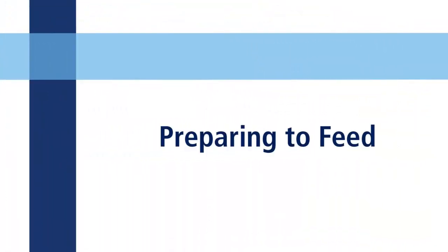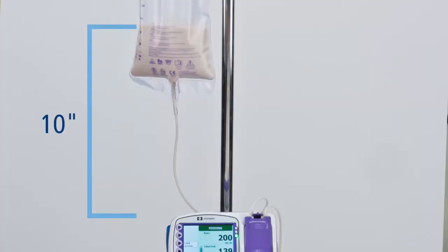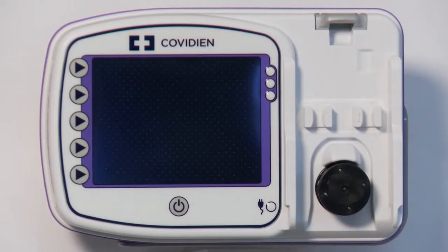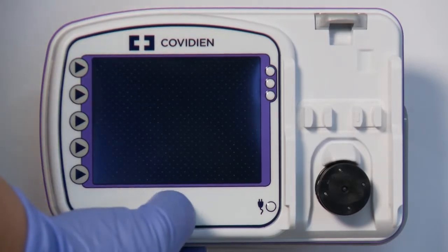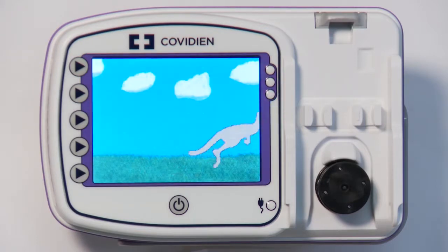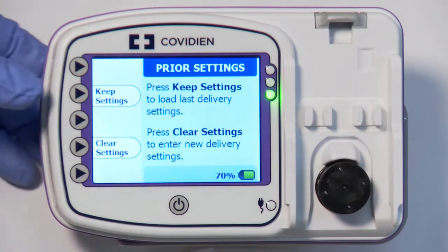Preparing to feed. Hang the prepared feeding set bag or fluid container so the starting volume of fluid is 10 inches above the top of the pump as shown. Press the power button centered below the pump screen to power up the pump. If you have used the pump previously, your last settings were automatically retained for you. Press Keep Settings to keep the settings from the last feeding.